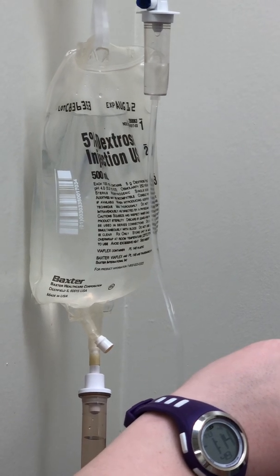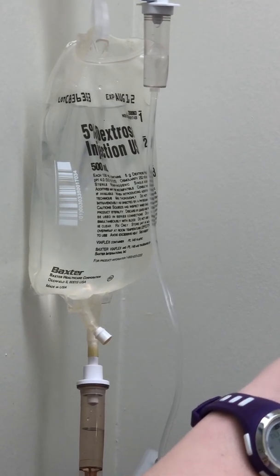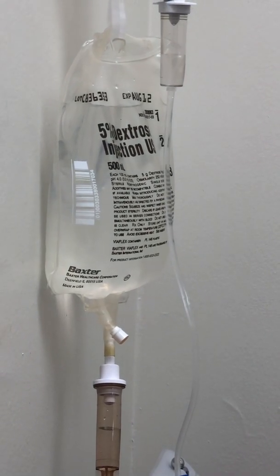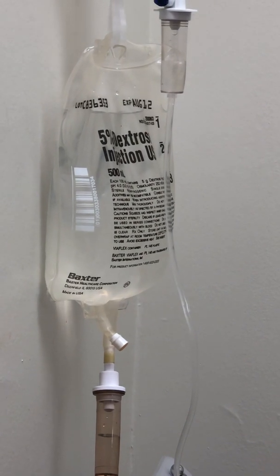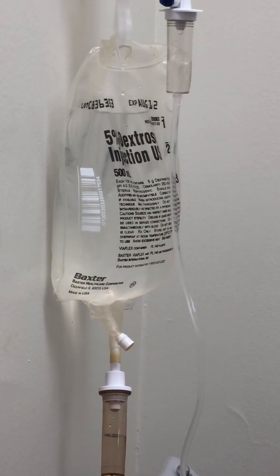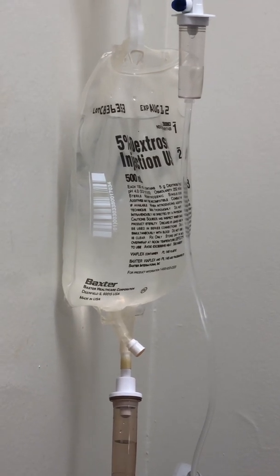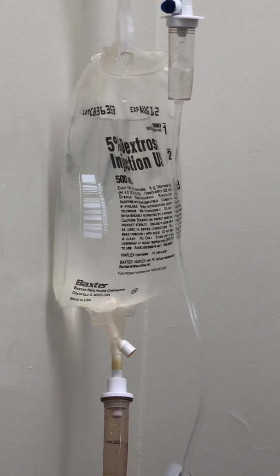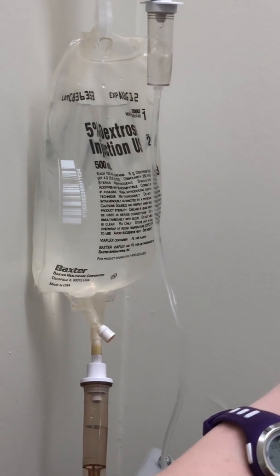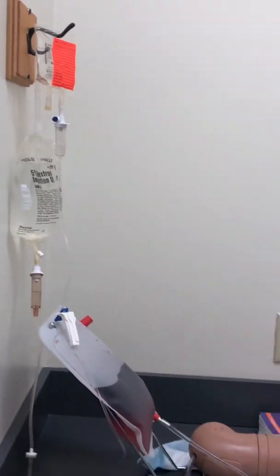Three. 4. 5. 6. 7. I've got 8 drops per minute, and that is within my 1 minute time range. Okay, now I'm gonna let that infuse.